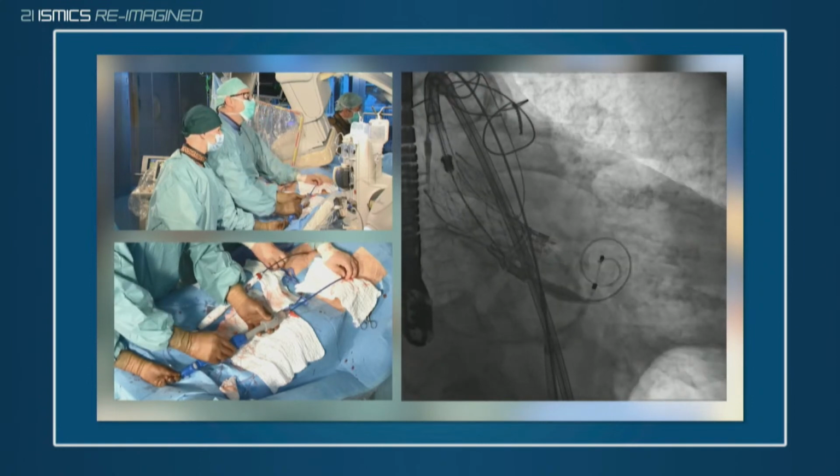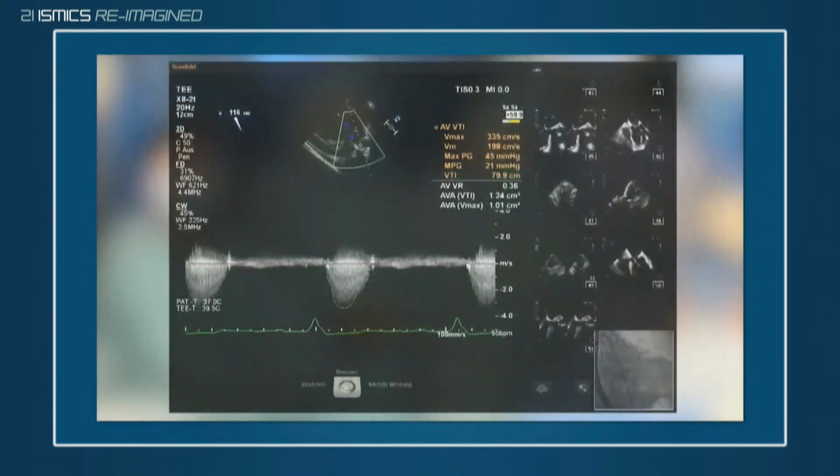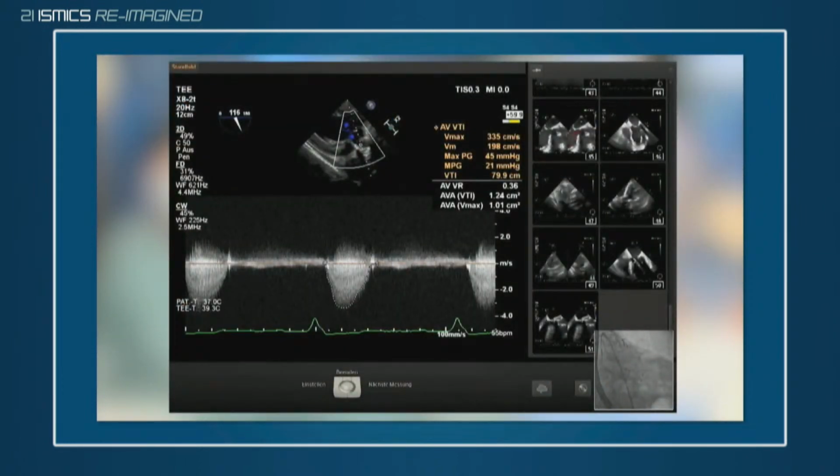So our next step is to evaluate what we have achieved. We can see maximal pressure gradient still 45, mean 21, so very similar.